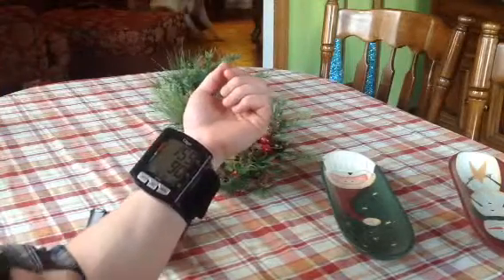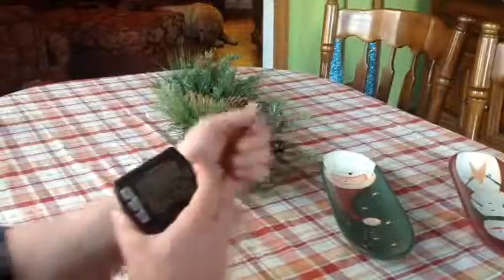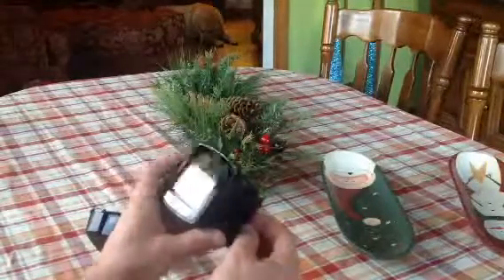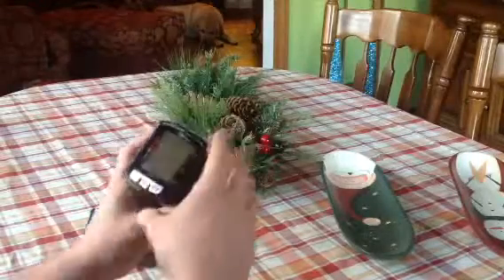It'll store my readings for an awfully long time, or the readings of two people for half as long. Still very reasonable and easy to use — you only have to push the one button.